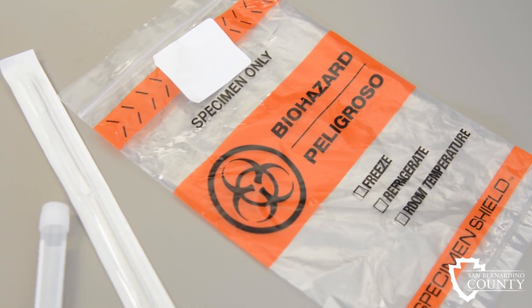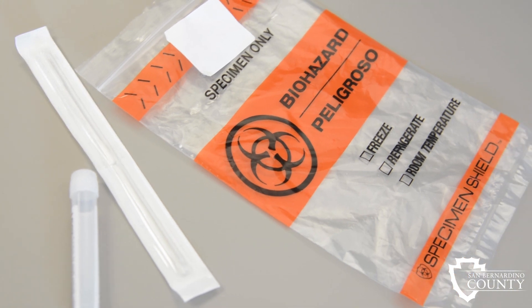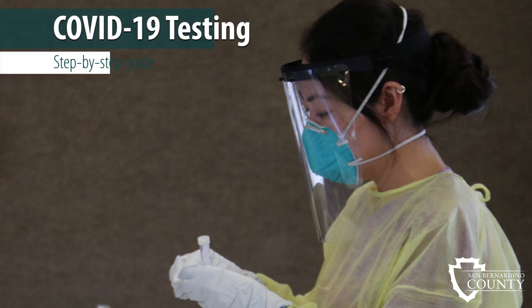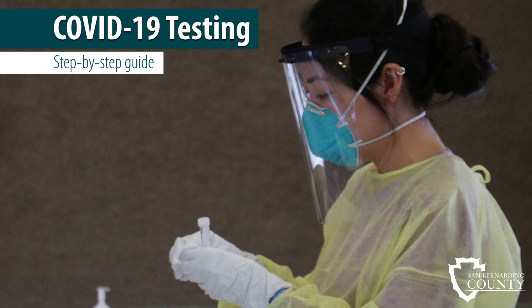San Bernardino County cares about your health and well-being, and we would like to thank you for visiting one of our COVID-19 testing sites. We want to make sure that your testing experience goes smoothly, so here is a step-by-step guide on how to collect a sample for COVID-19 testing using a self-swab test kit.